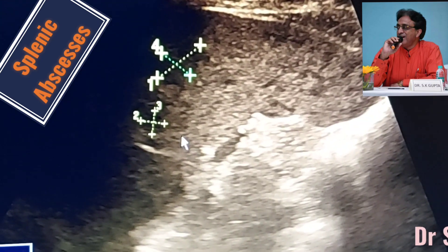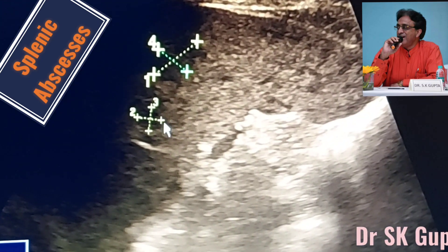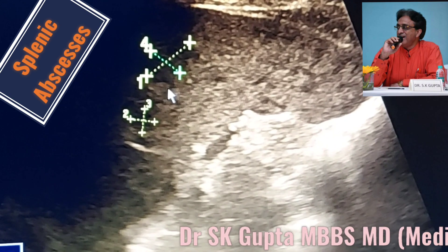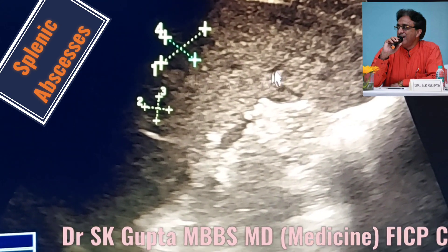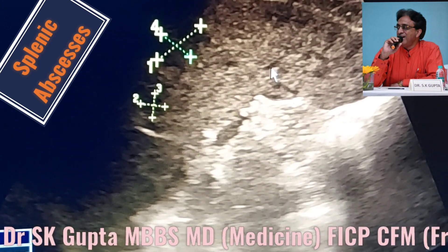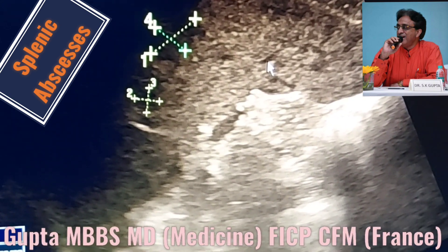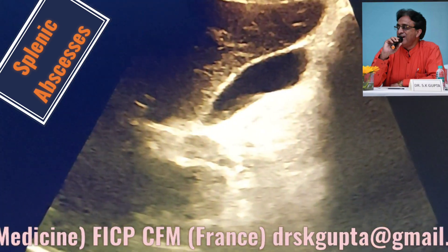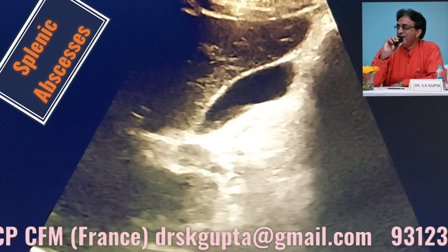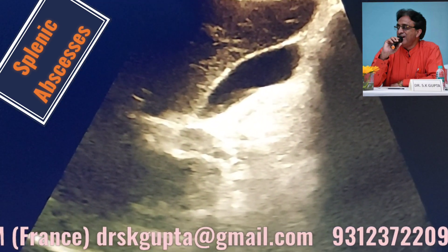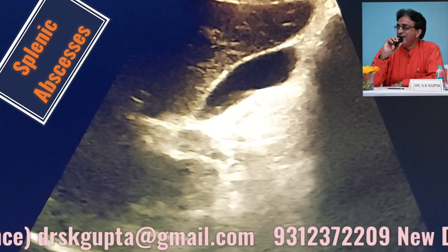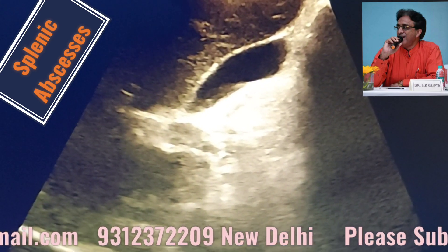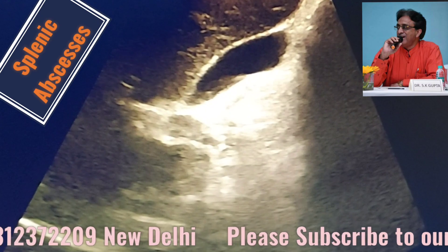When I measure the abscesses, I find that they vary from 8 millimeters to about 18 millimeters in size — they can be larger also. The liver in this patient was normal, there were no abscesses in the liver, and there were no lymph nodes anywhere in the abdomen, so we are dealing with a case of isolated splenic abscesses.